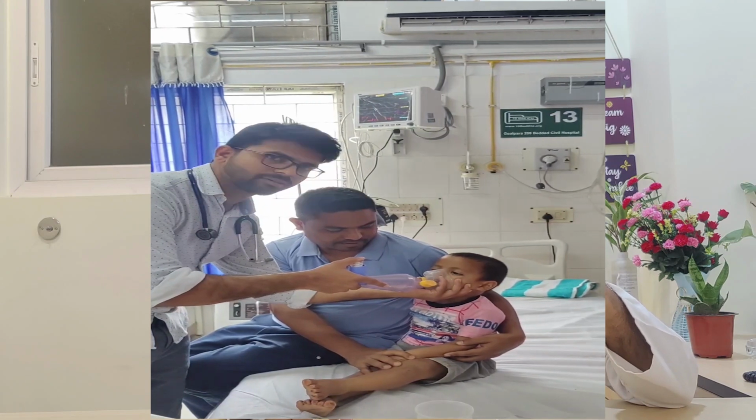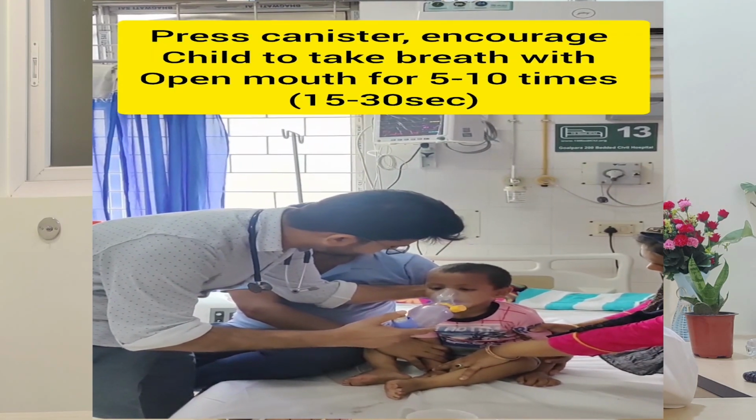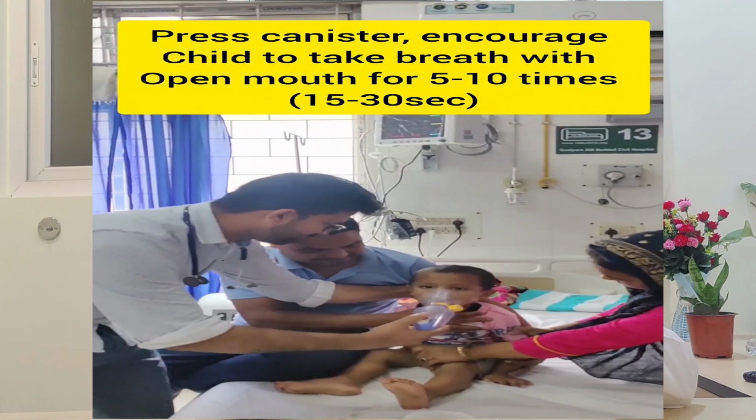But persons or children who are less than 12 years don't have coordination between pressing the canister, that's actuation, and the inspiration. So for a child less than 4 to 5 years, you should use an MDI inhaler with spacer and mask. How to? Attach the baby mask and inhaler to the spacer device. Cover the baby's mouth and nose with the baby mask. Press the canister and encourage the child to take breaths with mouth open 5 to 10 times. Remove the baby mask and wait for a minute. Repeat one more time.